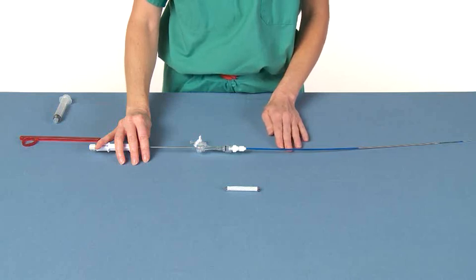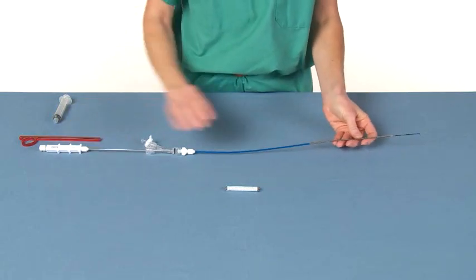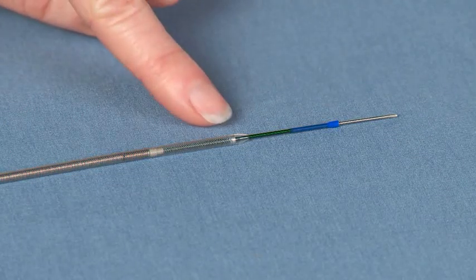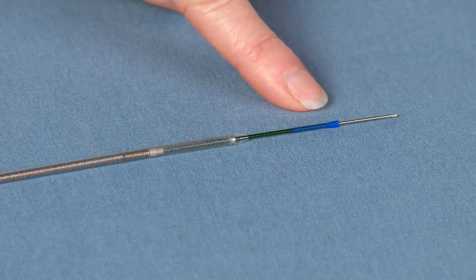Full release of the stent graft is achieved when the proximal marker bands of the stent clear the outer catheter. Do not attempt to resheathe the deployment system after stent graft release. After withdrawing the deployment system, visually confirm that the complete system has been removed by identifying the radiopaque marker band on the outer sheath and the flared blue distal end of the inner catheter.